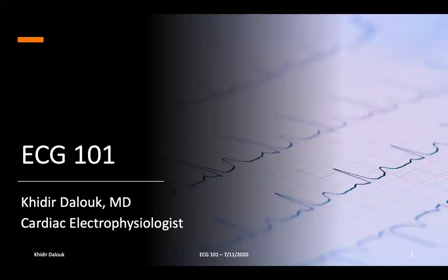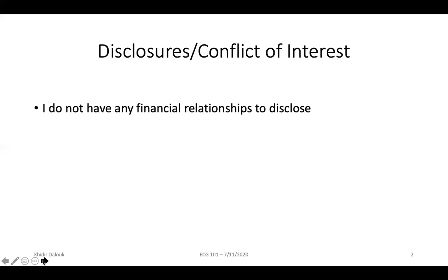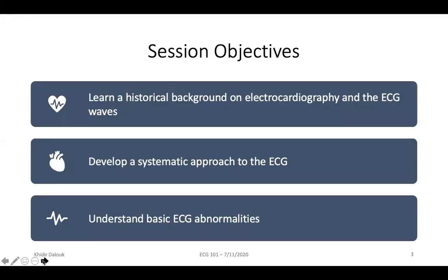So إن شاء الله hopefully الليلة يعني نعرف some of the fundamental and basic concepts about ECG. هو هيكون talk يعني mainly basic talk. Some of you might already know how to read an ECG. Some of you might be experts, but maybe learning a few bits and pieces will add to your knowledge. I don't have any conflicts of interest to disclose, or no financial relationships.